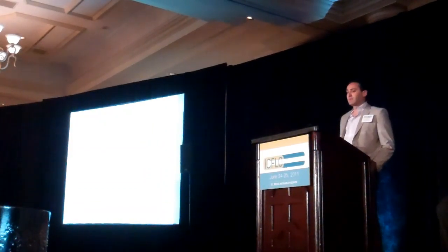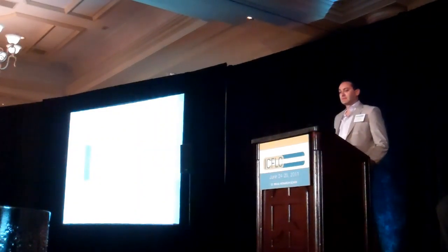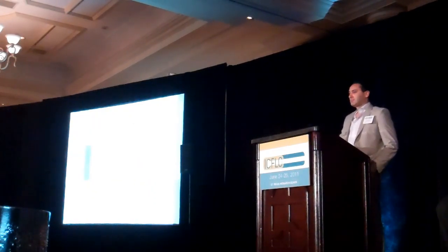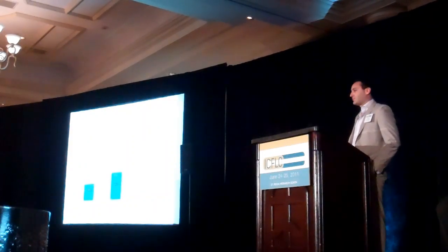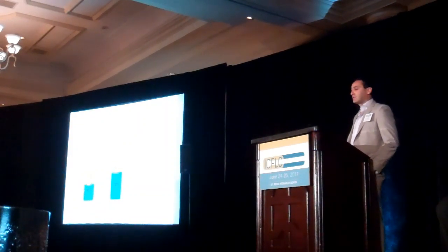I started with, are our current refractive results good enough? These are our refractive results, and this is the percentage of patients that come out within plus or minus 1 diopter of their target. We had 74%. The causes can be capsulorhexis, lens position, IOL calculations, and residual astigmatism. Now what happens within plus or minus half a diopter? Within half a diopter, 45% of patients hit that target, which means that 55% of patients are not delivered within plus or minus half a diopter after surgery.